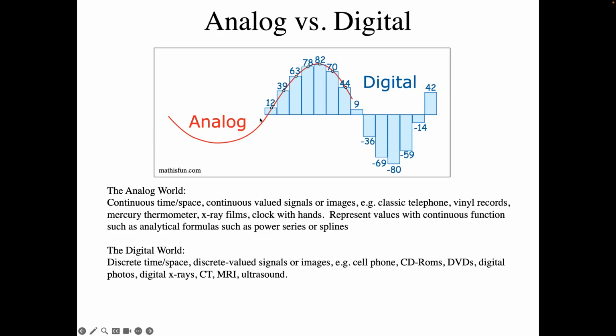So that is essentially a continuous, or an analog, function. Along comes digital recording, and if I have my analog wave here, I can essentially sample discrete values of that analog wave and just remember those numbers. So I don't need the entire continuous signal. I just need to remember a finite set of numbers, and I can transmit that signal. And it's much more efficient than carrying around analog signals, unless you can write down an equation for the analog signal. If you can write down an equation, then that's really efficient. If it's like sine kx or something, then you only need a few symbols. But that's not the case for recording. If you're recording somebody's voice, you very rarely write down an analytical function for the voltage of their voice.